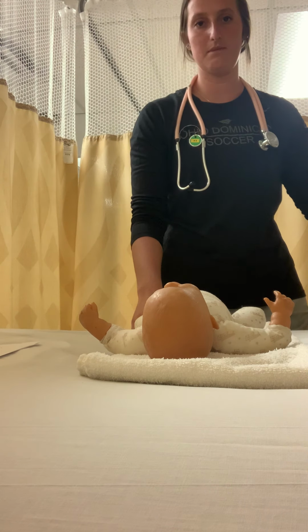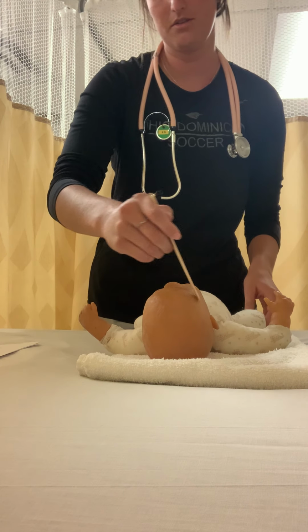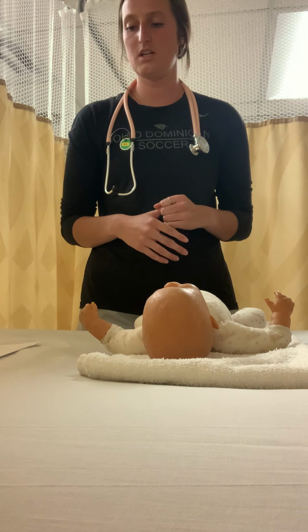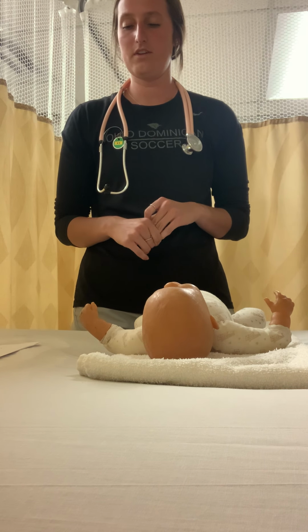I would then take the baby's temperature, and I would do the temporal temperature. So I'd go over the forehead, down to the ear. And then a normal temperature would be 97.7 to 99 degrees. And the patient doesn't appear to have any signs or symptoms of an infection.